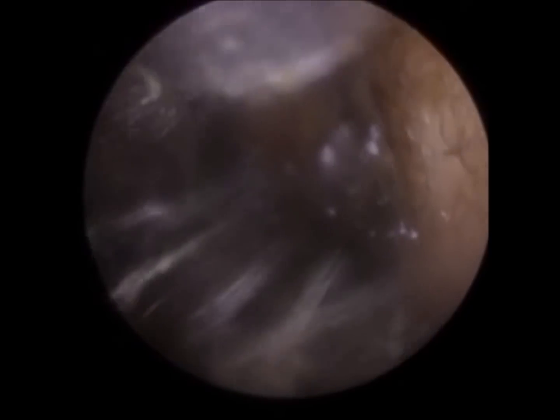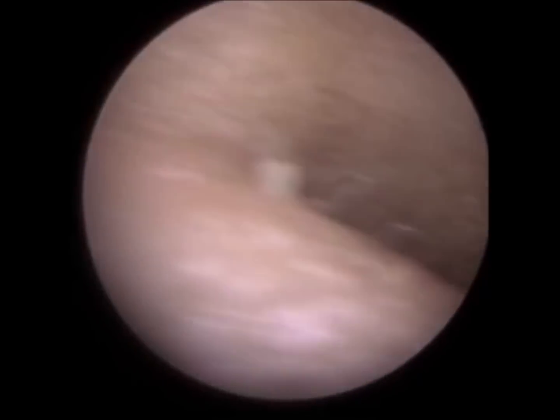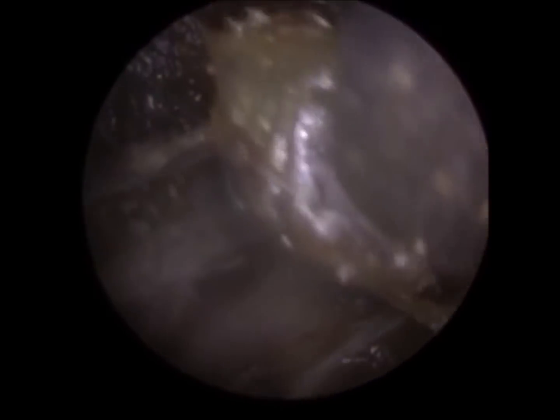So just trying to loosen this plug of wax, getting a good suction grip, and I'm just wriggling it, going backwards and forwards, round in circles. And got another layer there. So this piece of wax is probably about 1 centimetre in the ear canal, so we're on the cartilage portion. And there is some skin attached to the base and to the rear, so you can see that skin just coating and lining the wax. So we're just wriggling that loose and free, and that should detach itself hopefully.